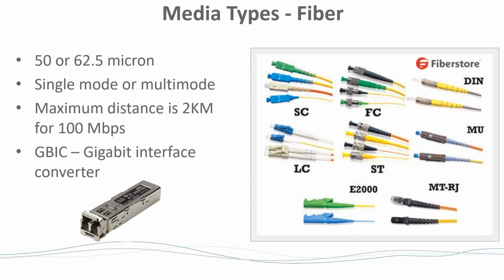There's different ones for all these different types of connectors. And there's some that are single mode, and some that are multi-mode, and some that are short run, and some that are long distance. So you've got to make sure that if you're buying something like this with fiber, you have the right GBIC. You've got to have the matching GBICs at each end. So that's GBICs and fiber.